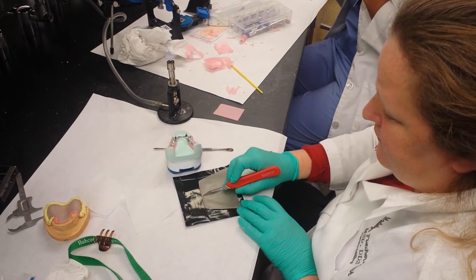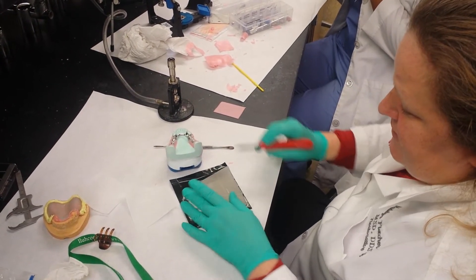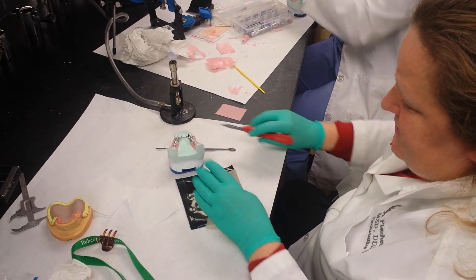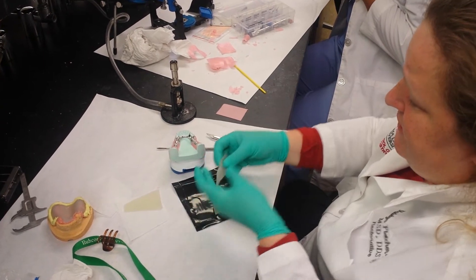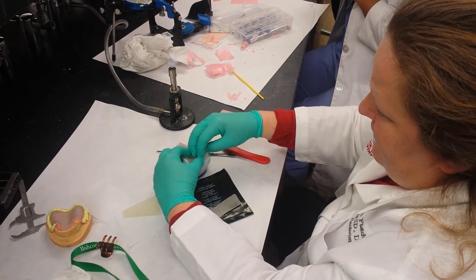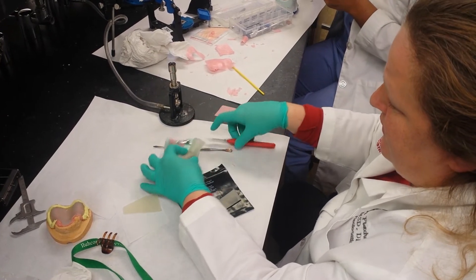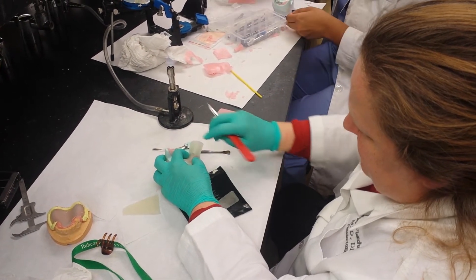We create a piece about the size that we need, so I usually cut it like this — cut a couple pieces like that. We take it over here and lay it on. Right now it's extra big, so we're going to cut some of the gross excess off.